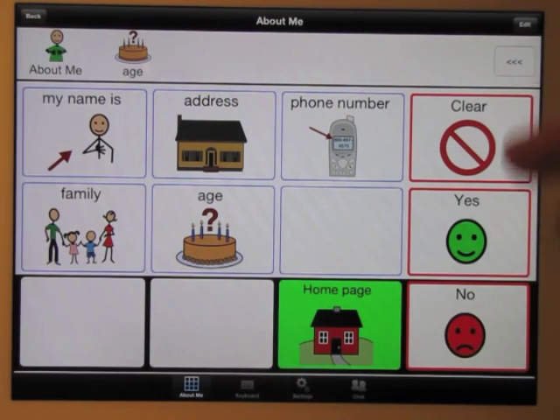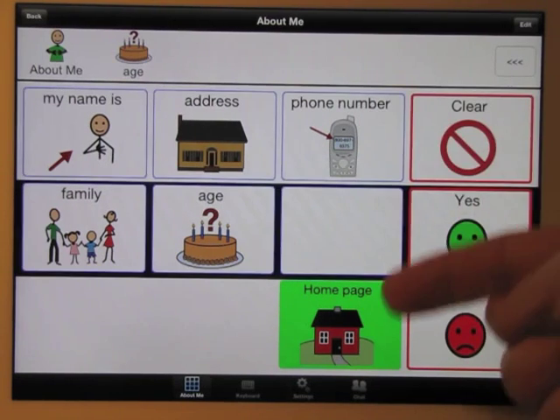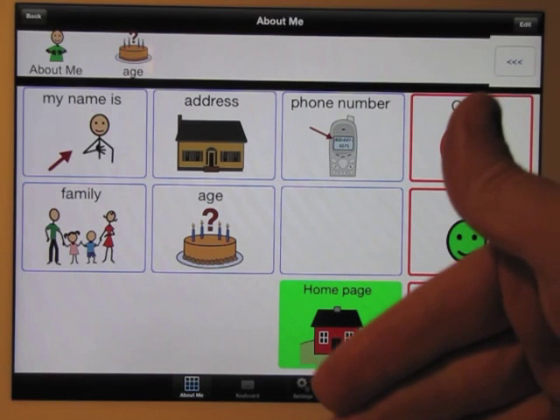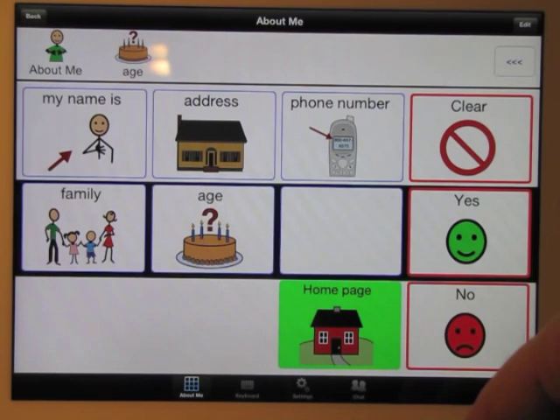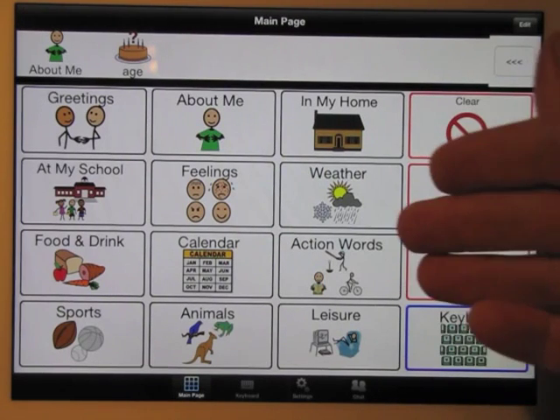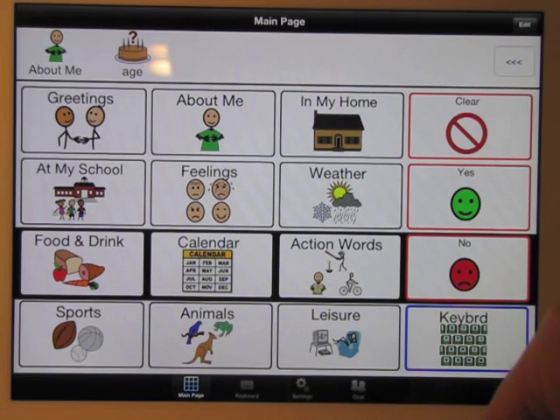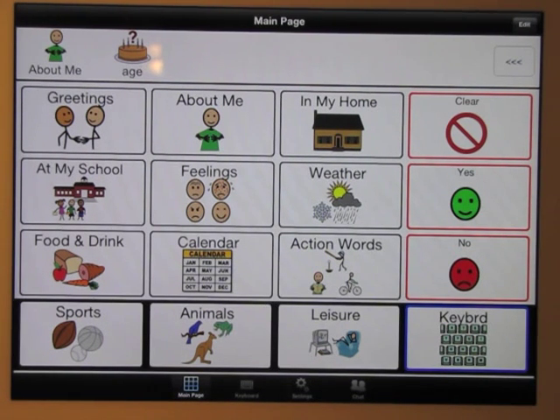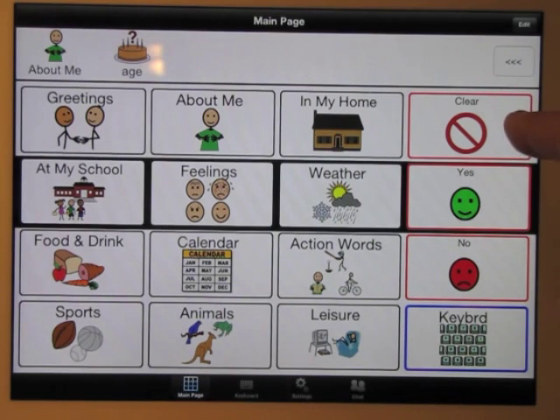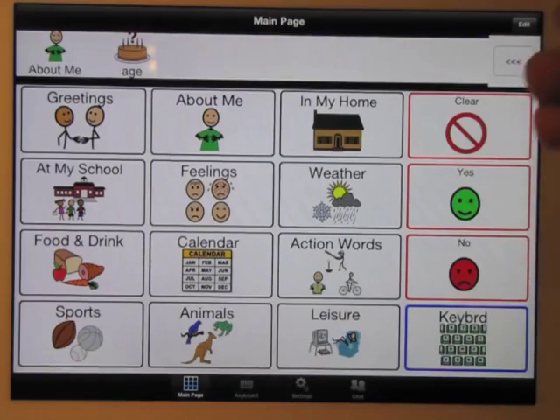One thing to mention while this is going through: it will go through these rows three times and then automatically go back to the main page. You can reset that to a lower or higher number. This is the second time through, and the third time through — there we go, it's gone back to the main page. That way it helps a user who may be stuck on an underlying page. You don't always have to have a main page button or a go-back or home button — you can just let it loop through.